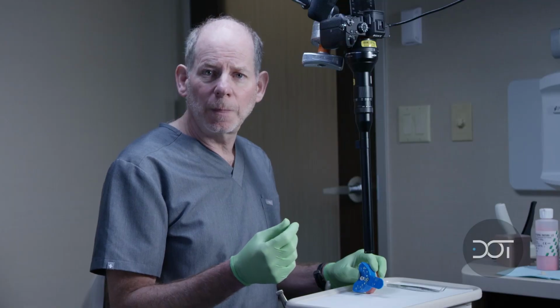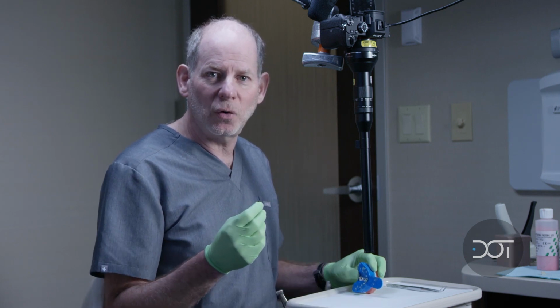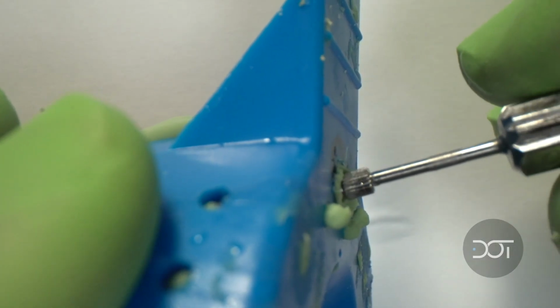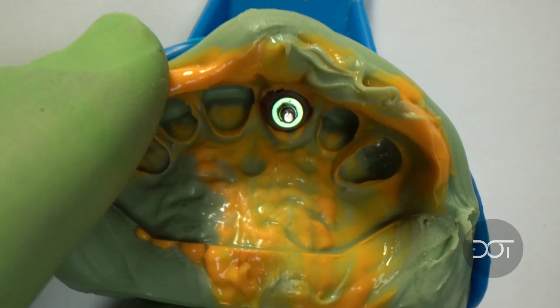Another tip for you, when I'm unscrewing the screw, I'm listening for a little click. When you hear the little click or you feel it, it's when the screw is completely disengaged and you know that it's loosened. I can also tell as I start to remove it, you can tell that it's disengaged now. All right, we'll go ahead and carefully remove the impression. All right, we've taken off the impression. Let's take a look.